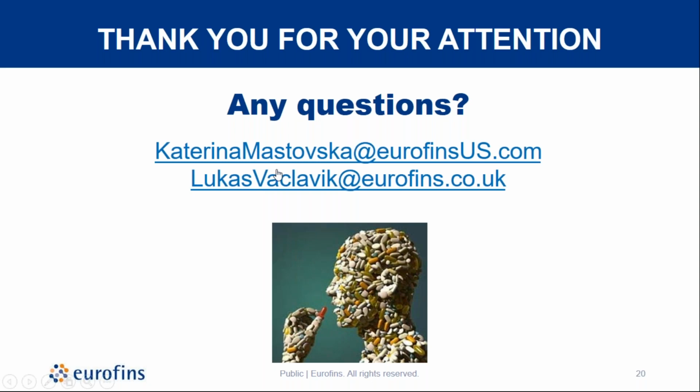I guess this one is for me. So no, there is no method in the current USP 561. But in addition to the list of pesticide residues and their limits that I showed in one of my slides, there are requirements provided in the chapter in terms of, for example, recoveries or RSDs.